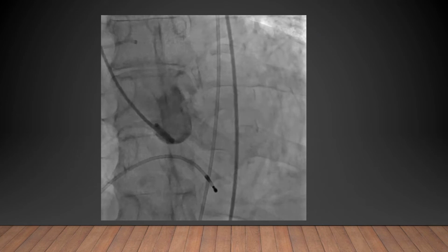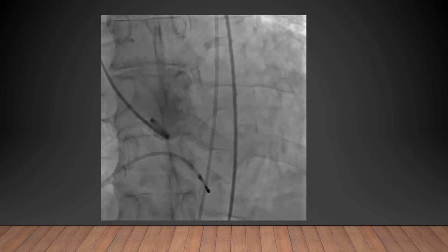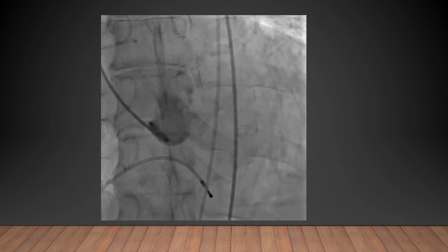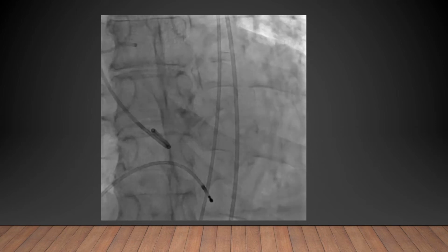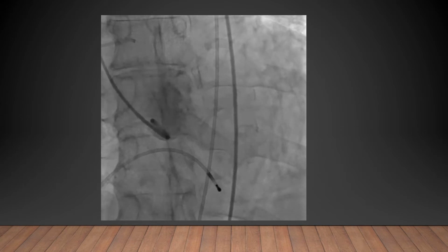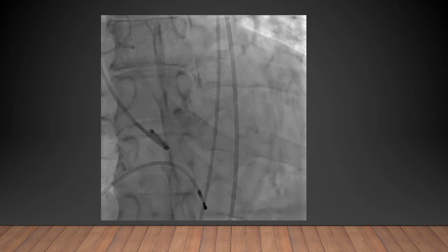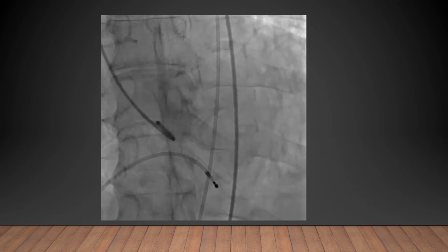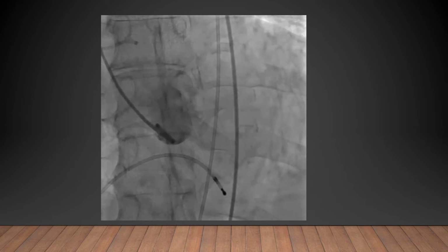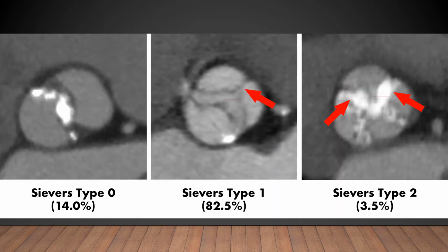If we were to look at it on an aortic root angiogram, you can see the bicuspid aortic valve. You can see the calcification, which is at the leaflet tips. Interestingly enough, this bicuspid valve is not as calcified as a lot of other bicuspid valves are, but nonetheless, you can see a difference between what would normally have been a tricuspid valve and this bicuspid aortic valve.